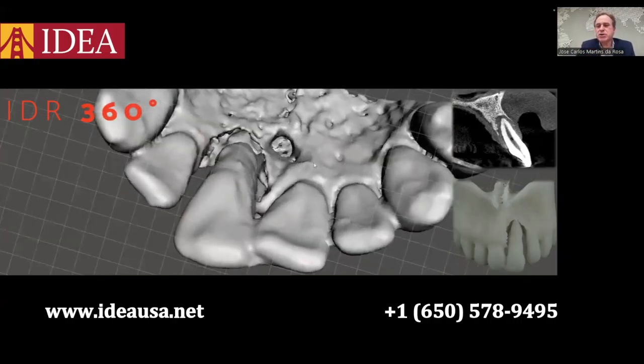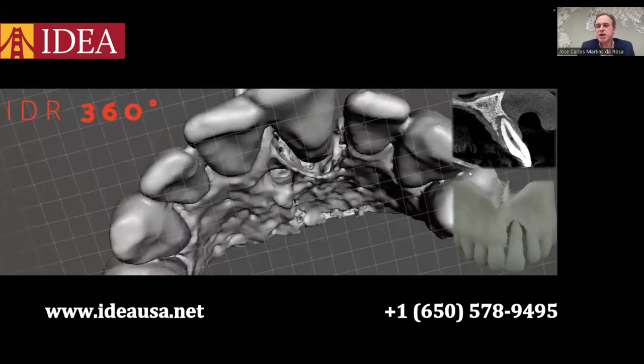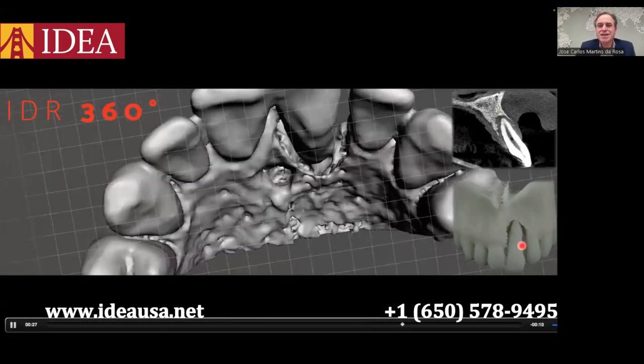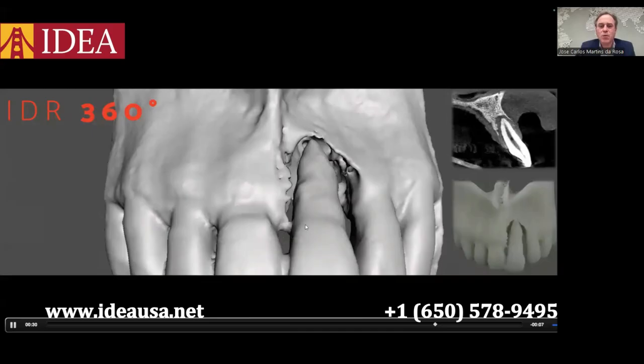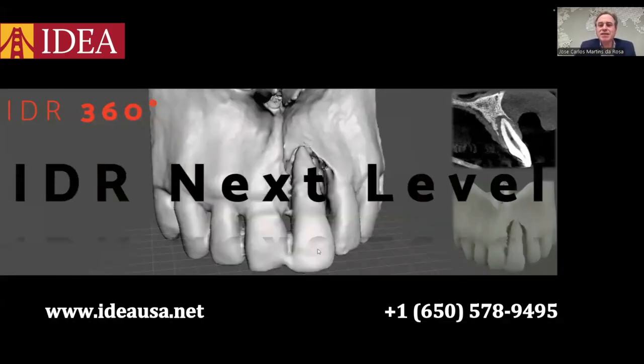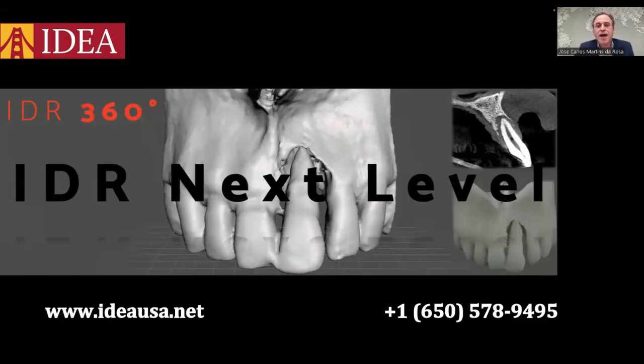As you see the image in the right side, it's missing the buccal and the palatal walls, and you see the prototyping, just a confirmation that the buccal and the palatal wall was gone. So this is what we call the IDR next level. This is the new way to manage compromised sockets in a very tough situation like this.